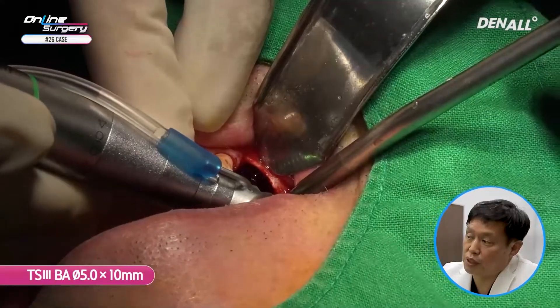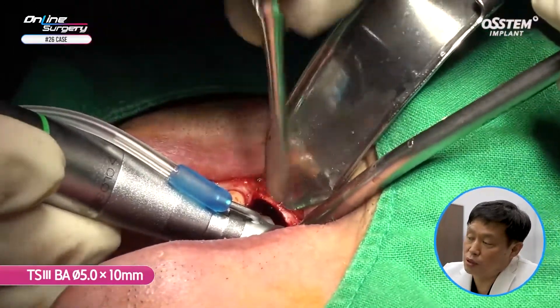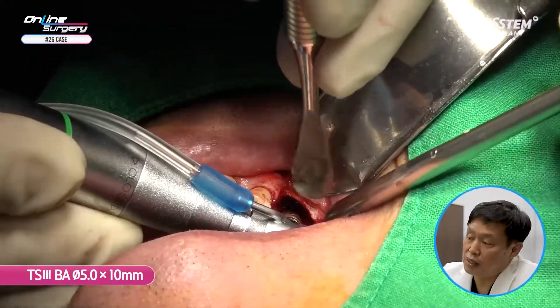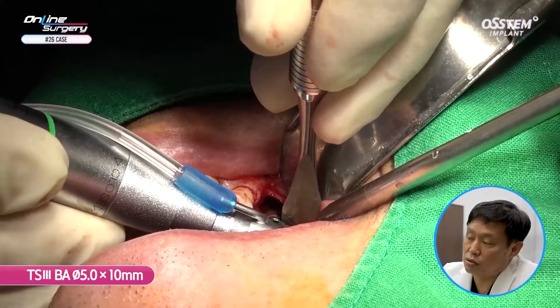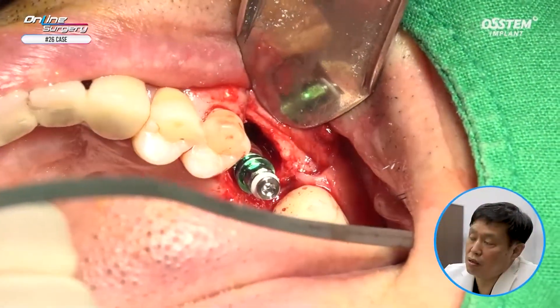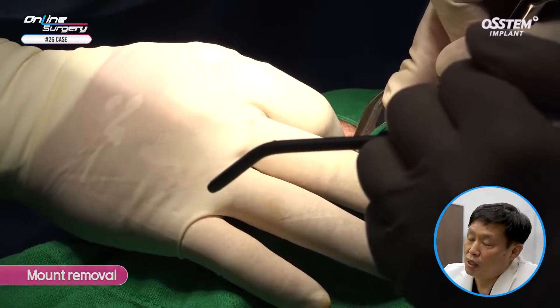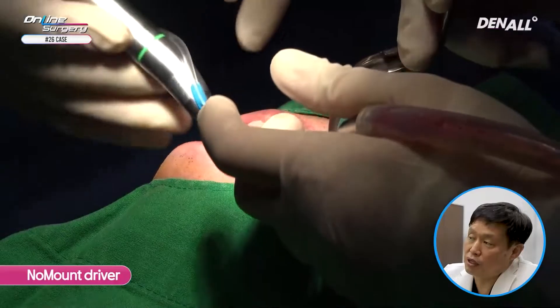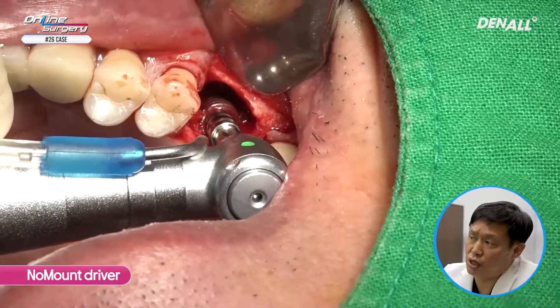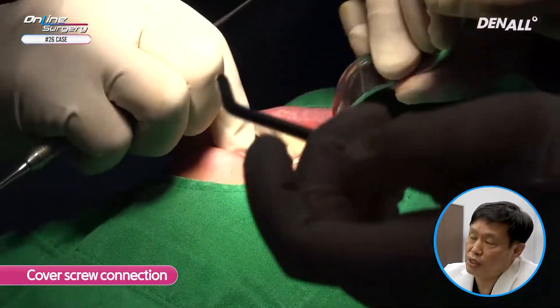There's no buccal bone, so you need to put more strength on the palatal side — it is not easy to get a good hold. If it is difficult, you can use a periosteal elevator to avoid implant slipping. The implant has been placed and stability is quite good. An open wrench is used to remove the pre-mount. I wanted to place it slightly more deeply. When using a hand wrench, there's no buccal side, so the implant can deviate — a no-mount driver is used with the engine to adjust depth.